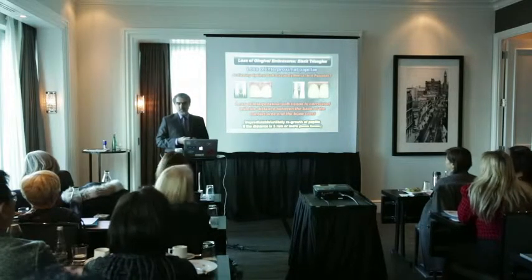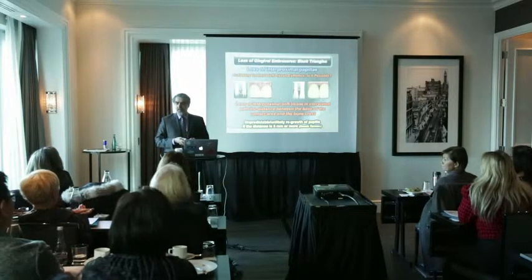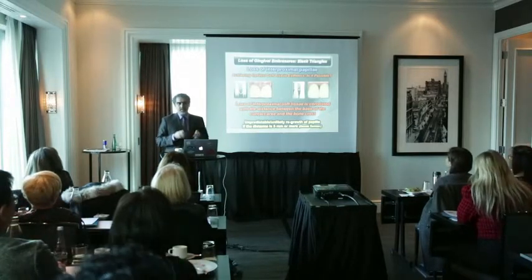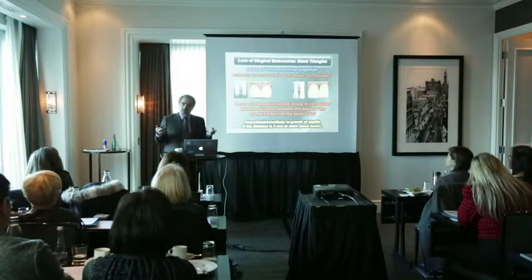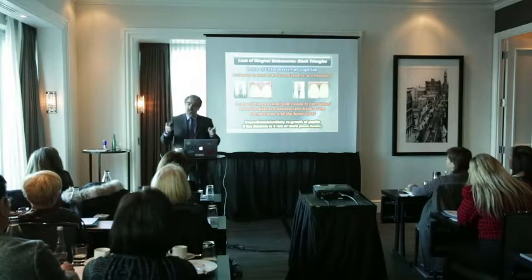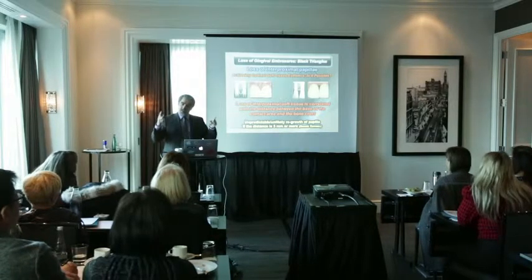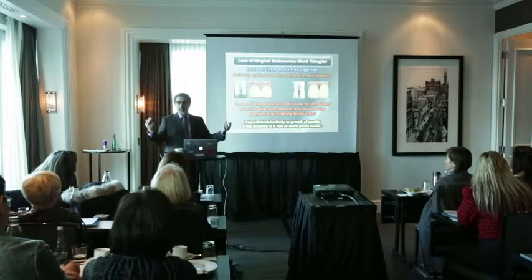So it's for the health of soft tissue around it. That's right, because nothing can go wrong. Not any support. No, absolutely not. It's just for the tight seal, so nothing can go underneath, and you're not going to have anything around the margin, the interproximal area. And strangely, around the embrasures, you're going to have the eruption of the papilla, which is a wonderful thing.